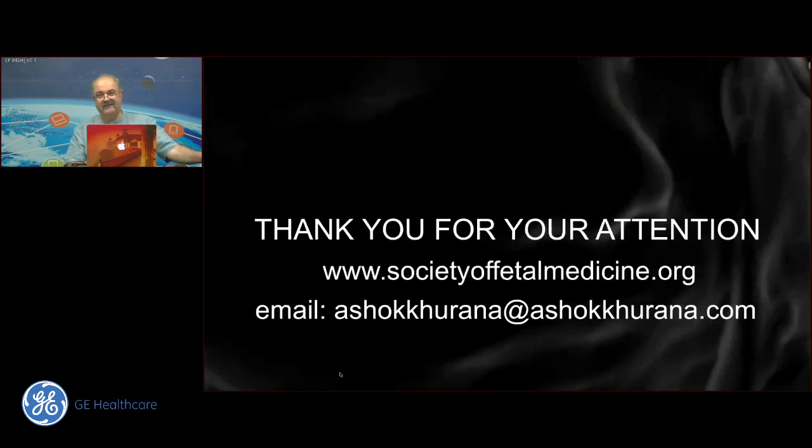We already have the first of our questions coming in, and it says, sir, just like by turning off harmonics can be useful to diagnose echogenic bowel, as you said, to differentiate the echogenic kidney. Yes, absolutely. You must always check the echogenic kidney by turning off harmonics, particularly when you're younger.